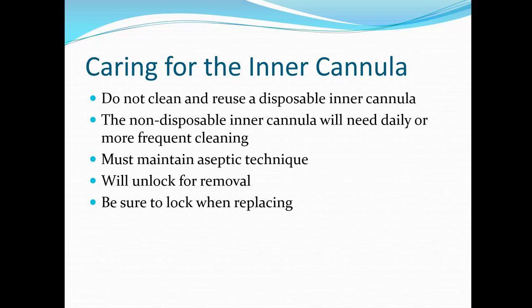Okay, and then care for that inner cannula. So this is the cannula that comes out and cleans. There will still be that outer cannula that will stay in. Some inner cannulas are disposable, some of them are reusable. If they're disposable, we won't clean and reuse it. We will just throw it away, and we will not reuse it.